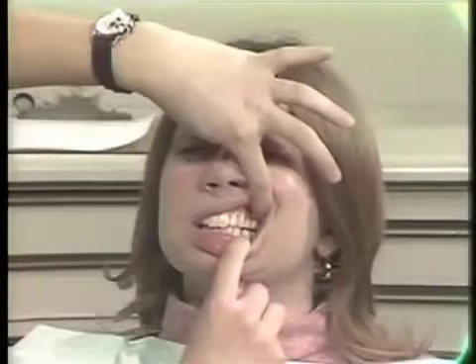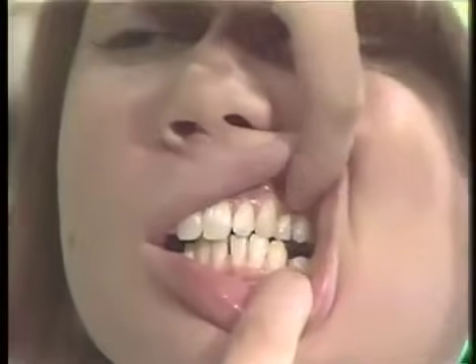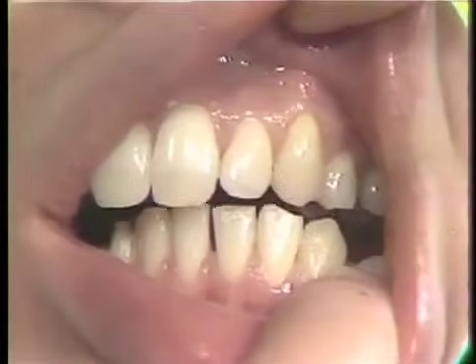And come out laterally. Are they together? Go back a little bit. Now tap gently. Can you see the blanching of the tissue above the cuspid?